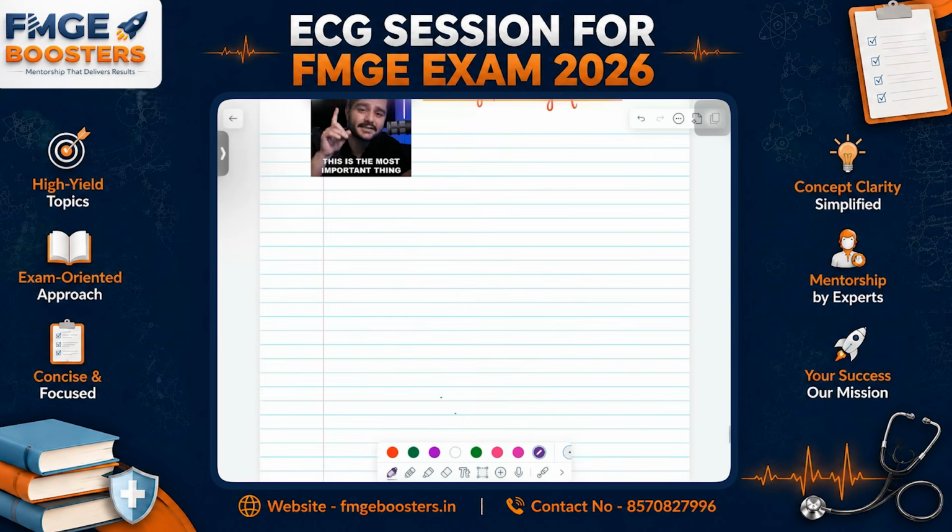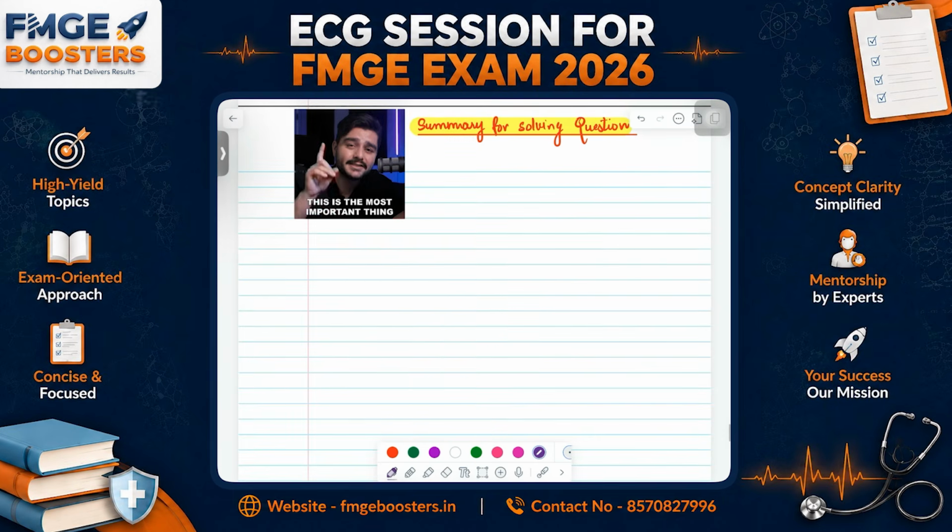ठीक है चलो, सबसे पहले when we are seeing a question in exam the very first thing we are gonna say is if a patient is stable. If a patient is not stable, then what do we directly do? बताओ. Not stable means shock दे दो. Shock. Right. We will directly give shock means defib. ठीक है. Now if a patient is stable, let's say he is stable, yes. We did QRS, right? हम QRS देखेंगे. Now we are seeing QRS, you have to tell me wide QRS, we saw wide QRS, right?